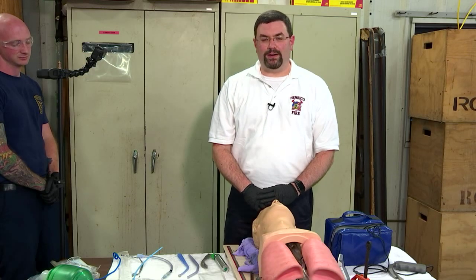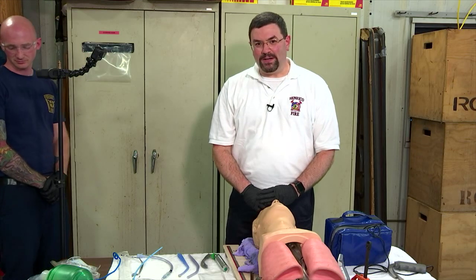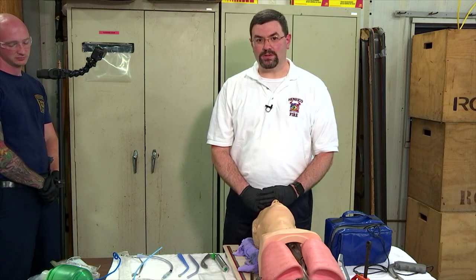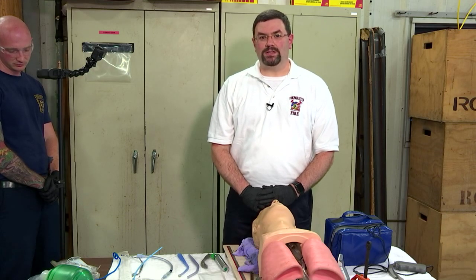I'm here today on a very non-air conditioned 90-degree day at the Woodman Road Training Center to talk to you guys about a new airway technique. Hopefully you've heard some of the hustle about it. It's called the SALAD technique, or suction assisted laryngoscopic airway decontamination.